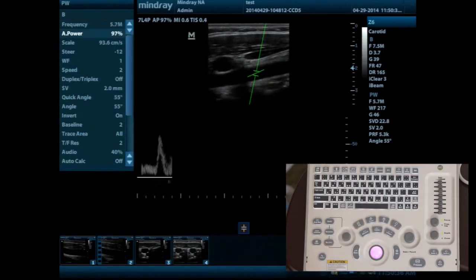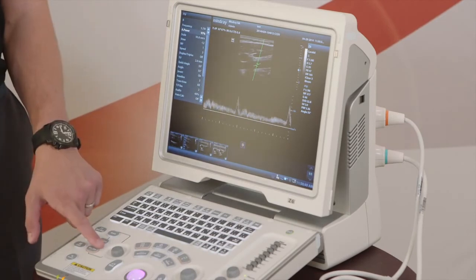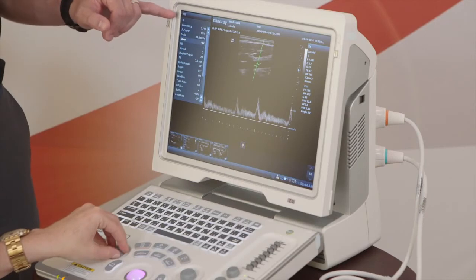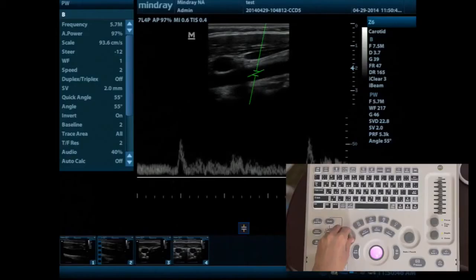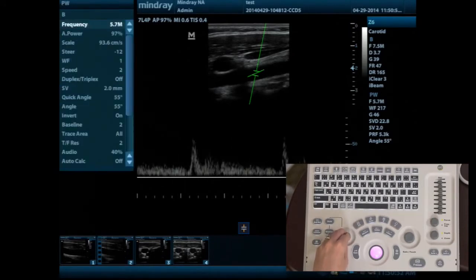And you go back to live imaging. You'll see that you do have other options here in your menu, which you're going to use your rotary nav key to scroll through. If you go up to where it says B at the top of the image, you do have the ability to click through and then bring you back to some of your other parameters, depending on the mode.